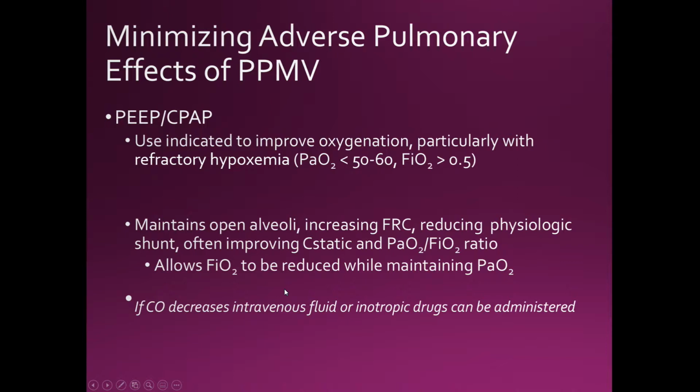So if you're cranking up your PEEP, most of the time you don't want to adjust your FiO2. If you're weaning someone off oxygen, you would drop your FiO2 first and then your PEEP, depending on the situation. We'll go over how to wean someone off PEEP later on.